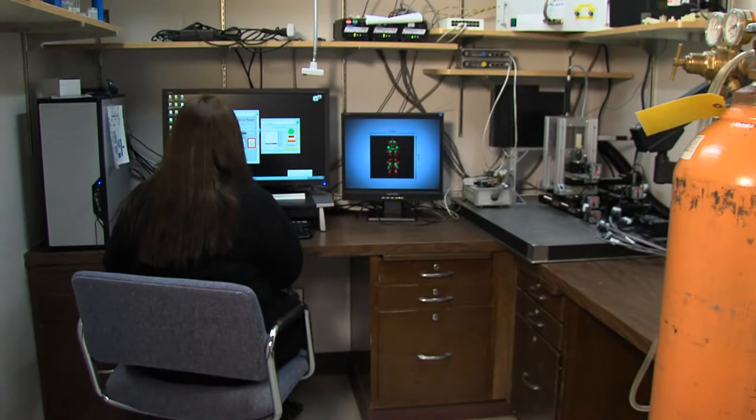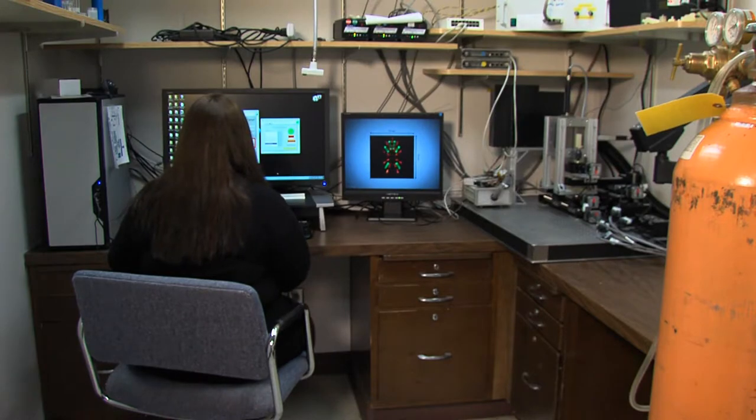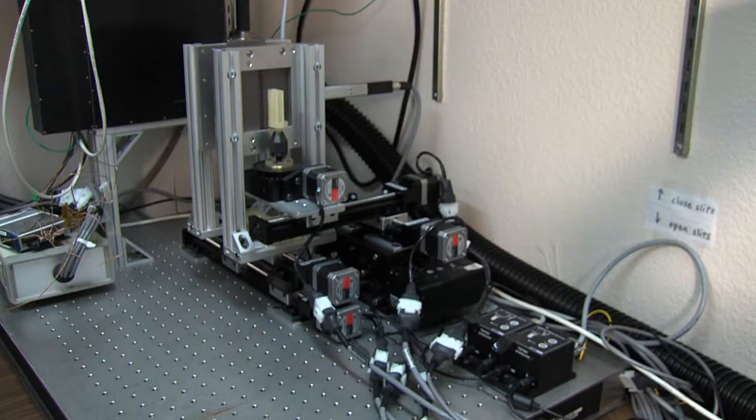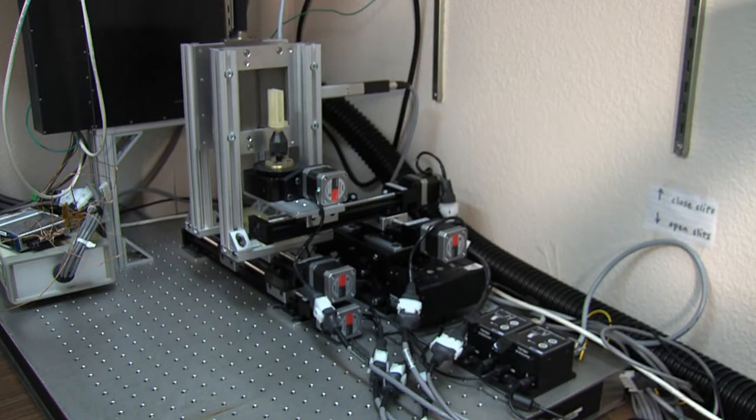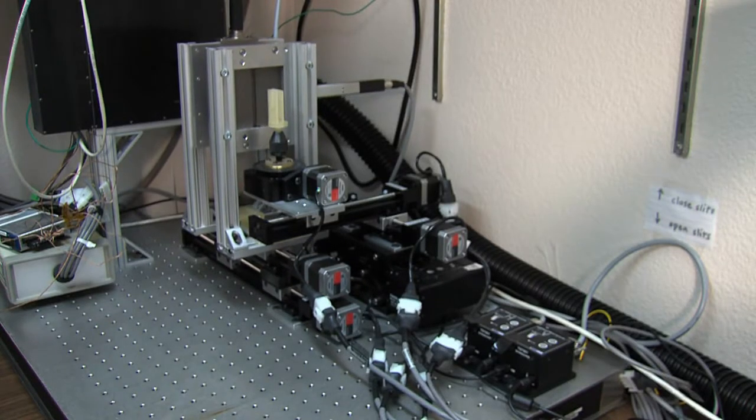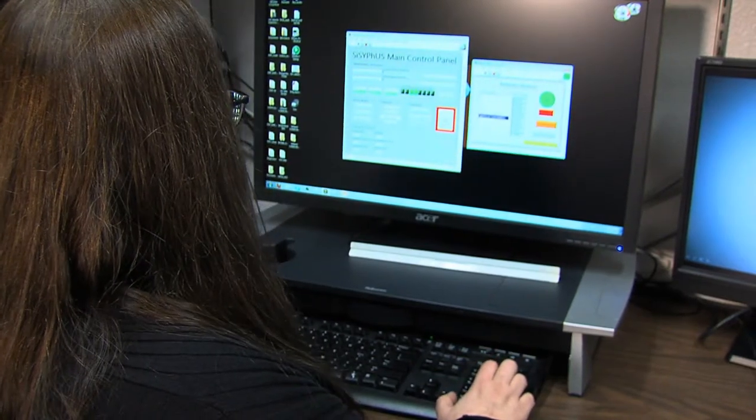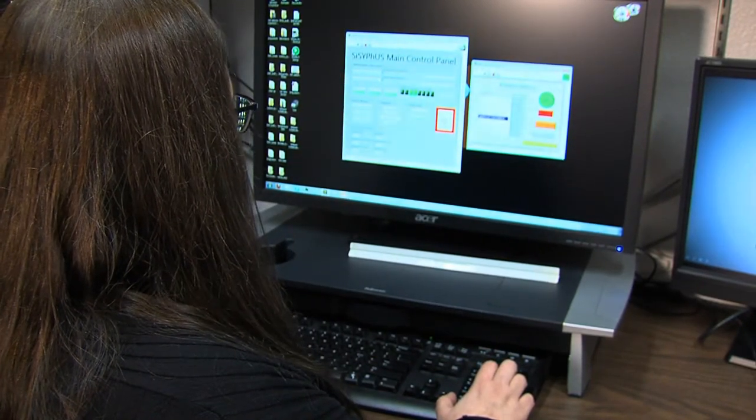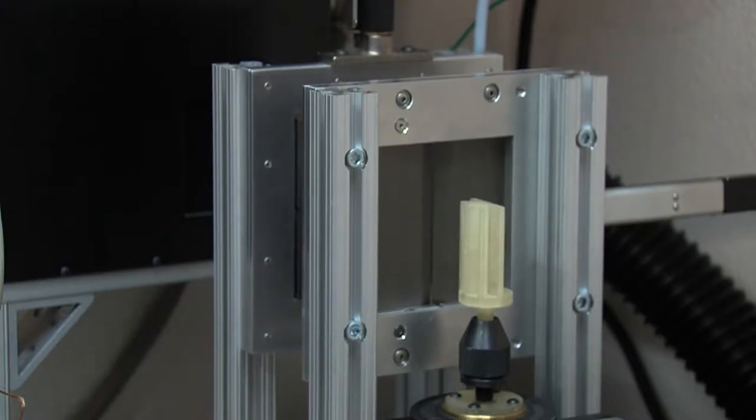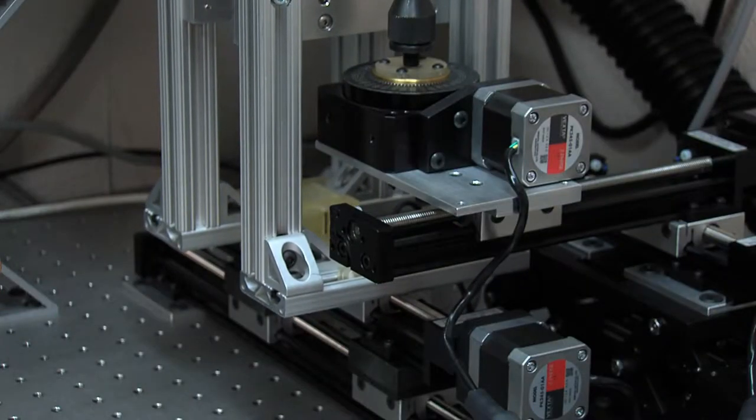This lab also holds one of our most technically advanced imagers to date, a system that combines the power of a precisely engineered skew-slit collimator with a true-megapixel solid-state gamma-ray detector with a 58-micron intrinsic resolution.